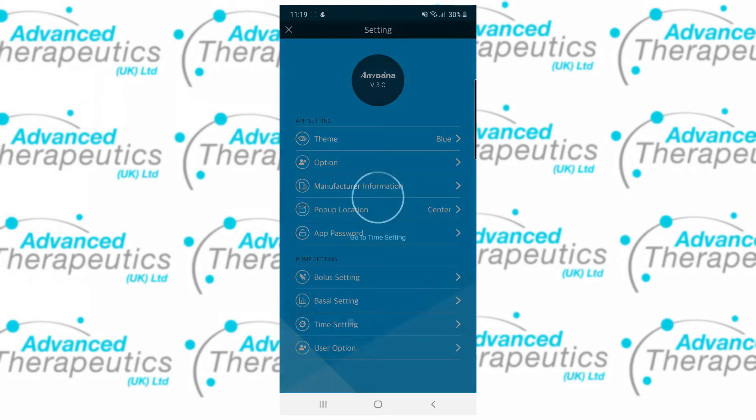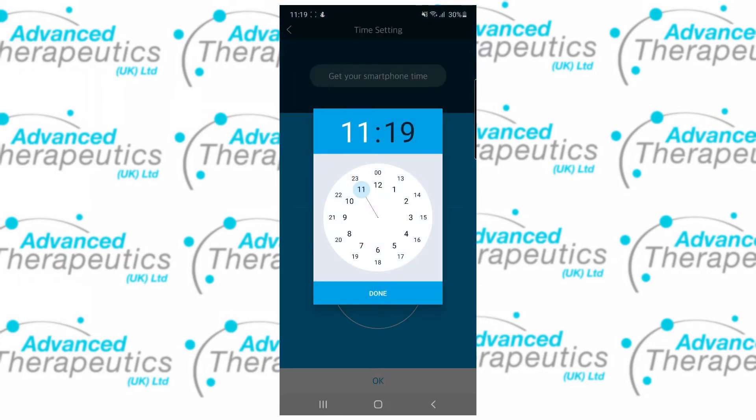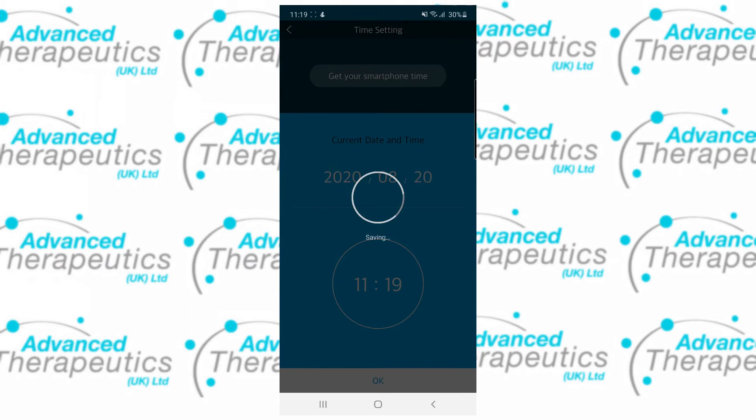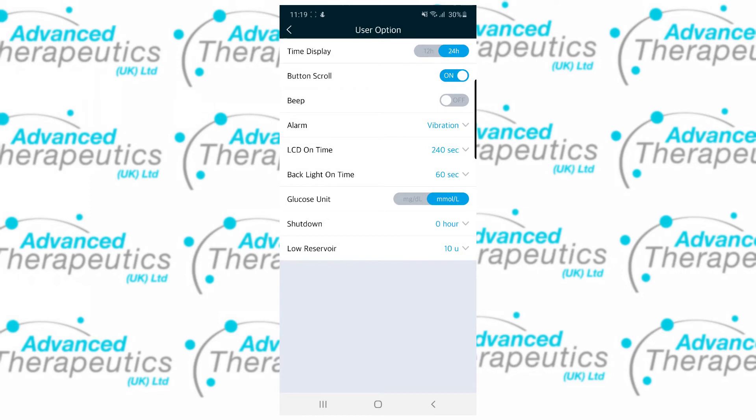You can also set your pump's time from here by either grabbing your smartphone time or setting it manually. And lastly, user options mimic the user options available in the pump to set to your personal preference.